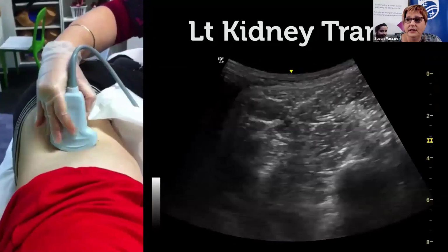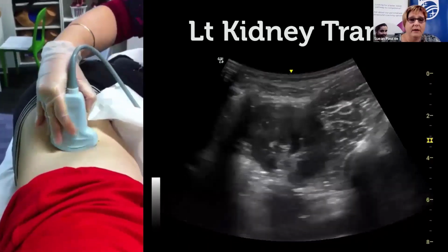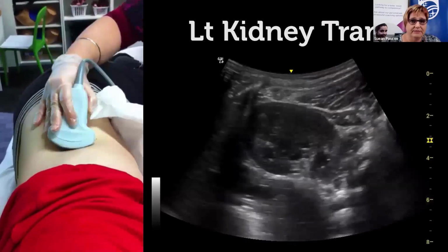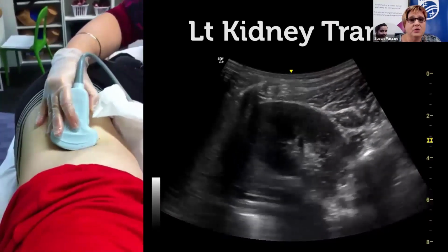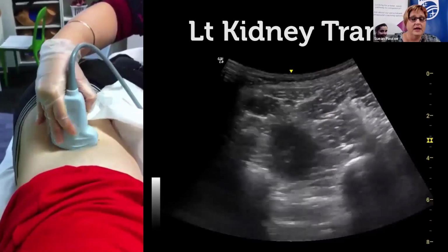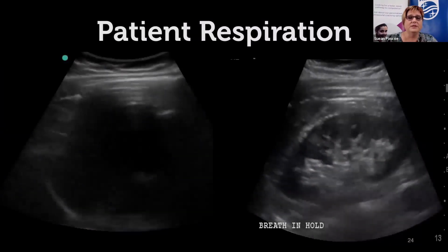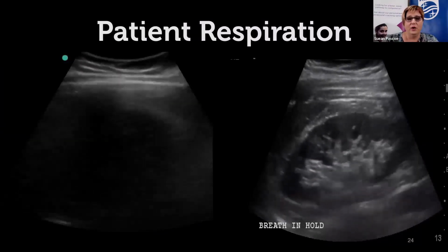And then we need to, in the transverse, make sure that we are tilting and fanning the probe or moving our probe to get a good picture. Now, in amongst all this, it's always good to get your patient to take a really big breath in, because what that'll do is just push all the anatomy down a little bit out of the way of the ribs so that we can get a better view on the kidney.